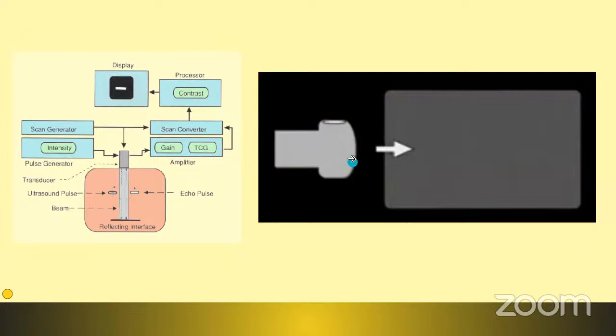Yeah. So as this probe produces the ultrasound pulse and it moves across the medium, along its path, it loses a lot of energy as it passes through a lot of materials around it, right? This might get dissipated in the form of thermal energy, mostly thermal energy. Yes. So this phenomenon is called attenuation. The denser the system and the longer the path taken by the ultrasound pulse, the more the attenuation would be.